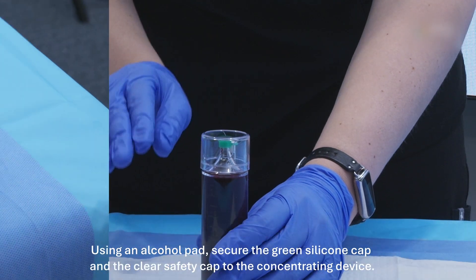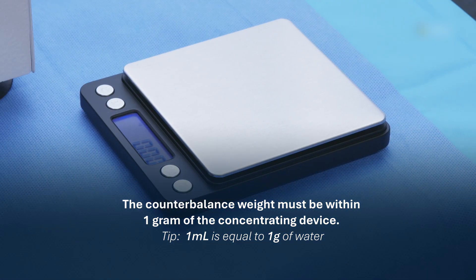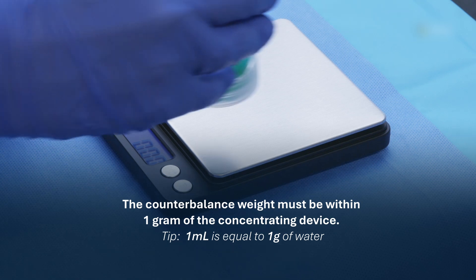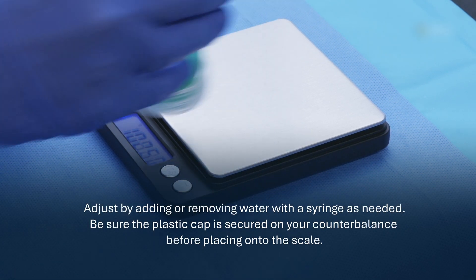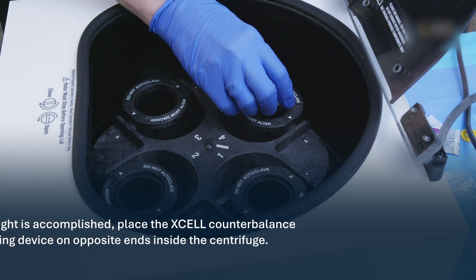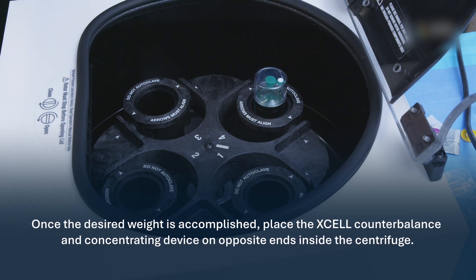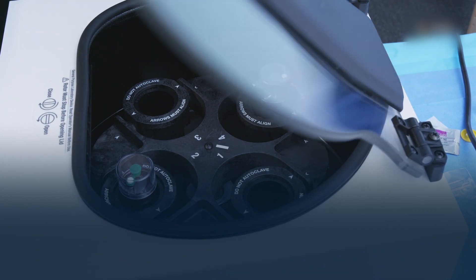Place the concentrating device on the scale to calculate its weight. The counterbalance weight must be within one gram of the concentrating device. One milliliter is equal to one gram of water. Adjust by adding or removing water with a syringe as needed. Be sure the plastic cap is secured on your counterbalance before placing onto the scale. Once the desired weight is accomplished, place the XL counterbalance and concentrating device on opposite ends inside the centrifuge.